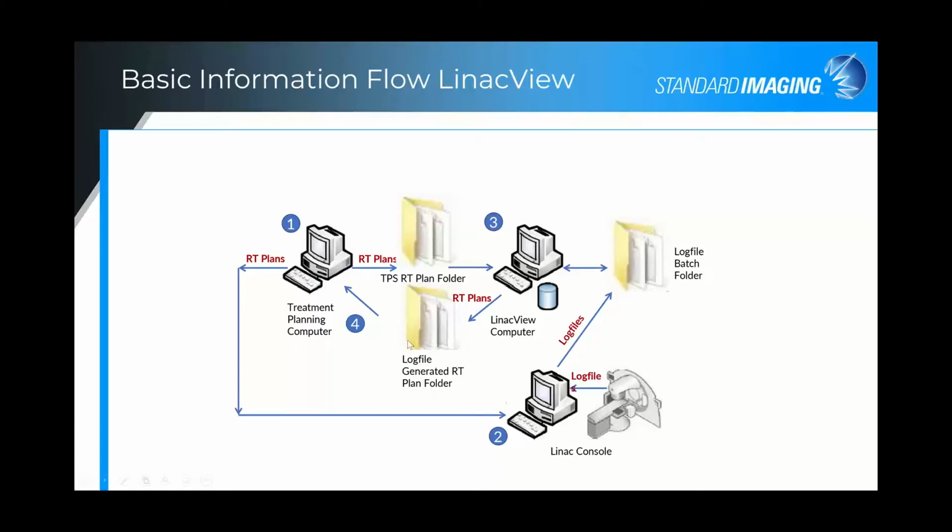Or, of course, you can link that to another third-party independent dose calculation engine as well, your preference. But it's a very direct comparison when you use your own treatment planning software so that you can see only the differences that are produced by differences in the delivery.